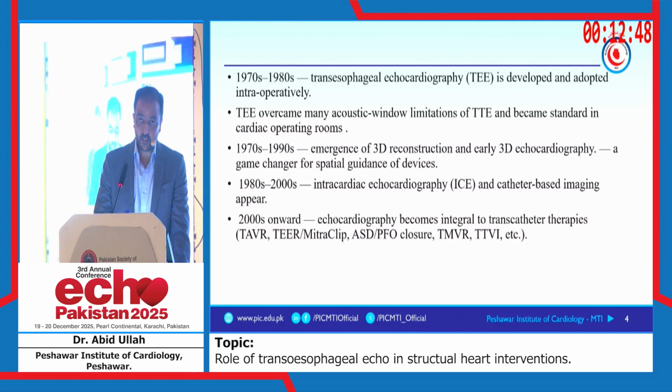Then in the 90s, the 3D echo reconstruction basically transformed the structural heart interventions. In the last 2 or 2.5 decades, we have seen the transformation of structural heart intervention because of the 3D echo incorporated in these procedures.